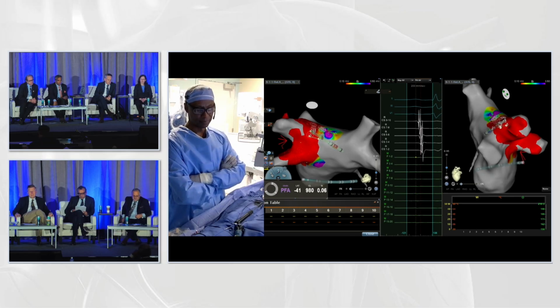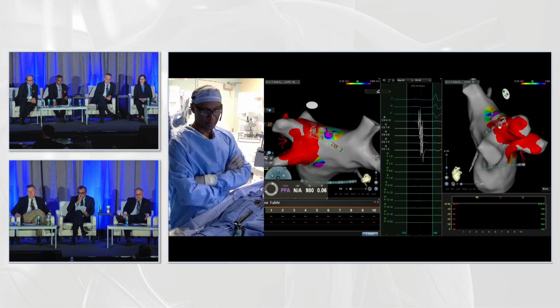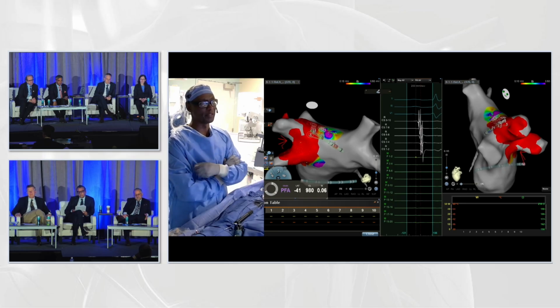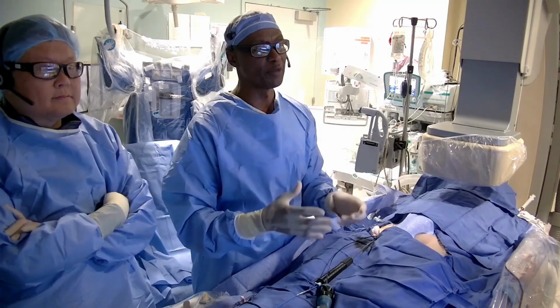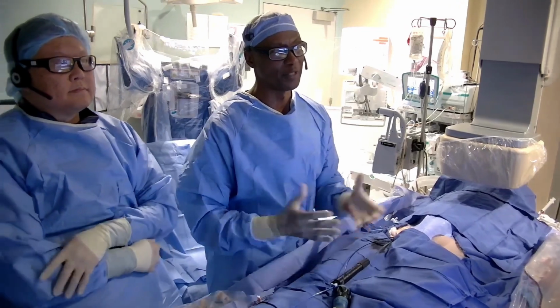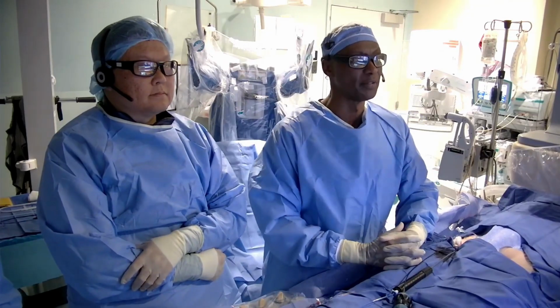I was just going to say, we're just about out of time. So if you want to just wrap up, and well, thank you. No, that's basically it. I agree with him in terms of the number of impulses, because you're delivering between so many electrodes, the field that you're delivering, you won't need to deliver in excess of 24 pulses.